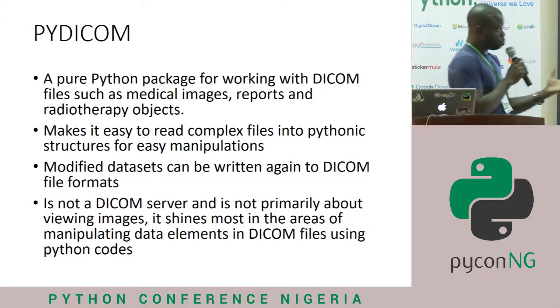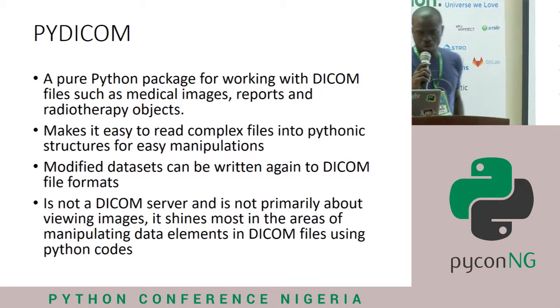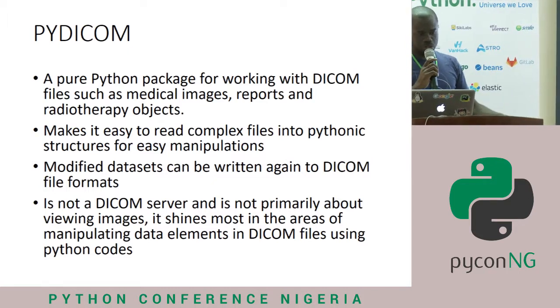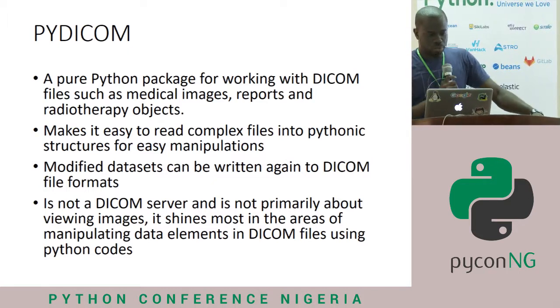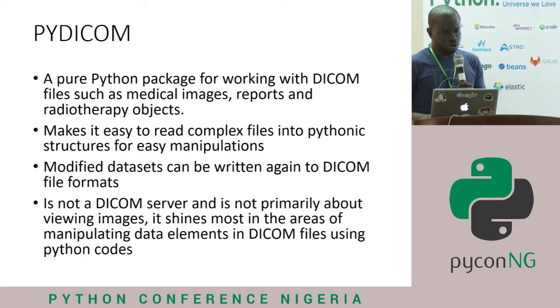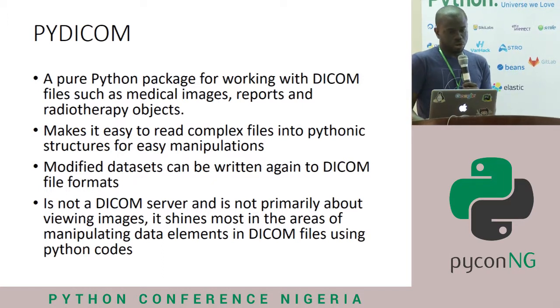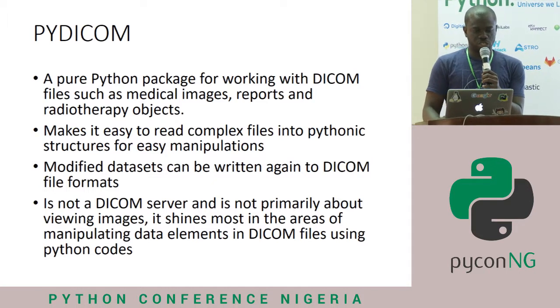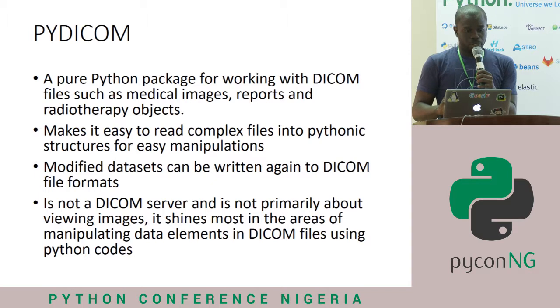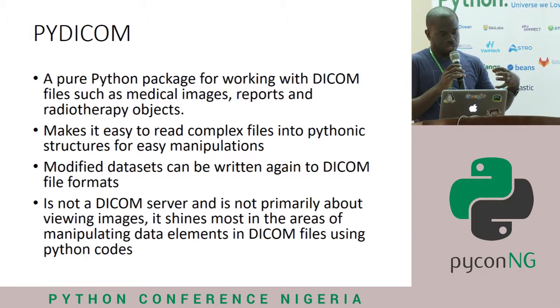So now to the real thing, which is Python and how it comes into play. So there is PyDICOM, a library that we're going to talk about, and it's a pure Python package for working with DICOM files such as medical images, reports, and radiotherapy objects. It makes it easy to read complex files into Pythonic structures for easy manipulations. Modified data sets can be rewritten again in DICOM files.